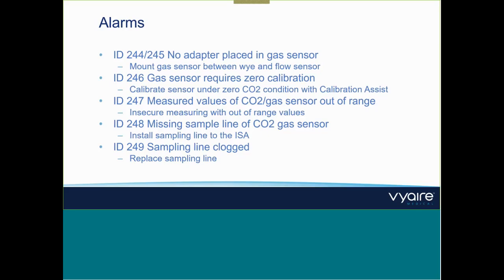But in non-invasive ventilation, it has a big advantage. So I know hospitals which use mainstream on invasively ventilated patients, and they use transcutaneous on non-invasively ventilated patients. Also, you see transcutaneous quite often because of the application in NICUs, and so it has advantages. And the disadvantage is the calibration process is rather cumbersome to date, and there's also a chance of erroneous measurement, because when the skin is sweaty, too warm, or too cold, the measurement is impaired when using transcutaneous measurement.